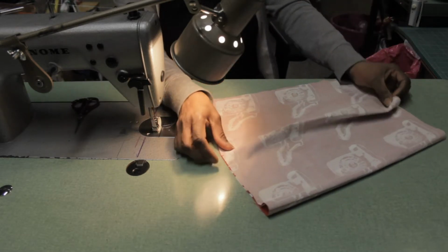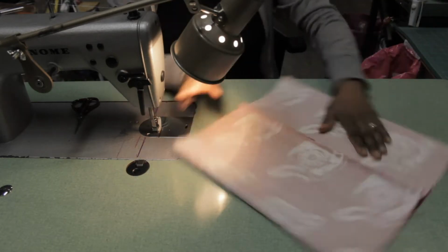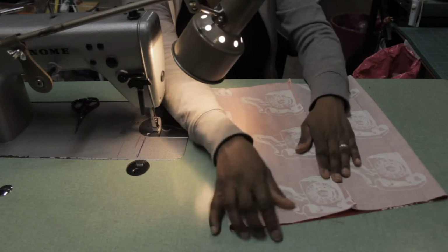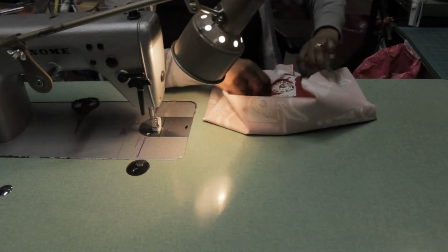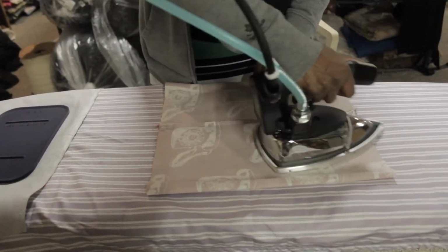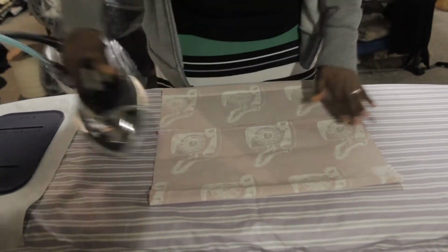The next thing we're going to do is take it to the iron. We're going to open it out, and we're going to press this to one side, and then we're going to fold these together and press them together. So let's go to the iron. Now we're going to press these seams. We're going to press them all to one side, like that.